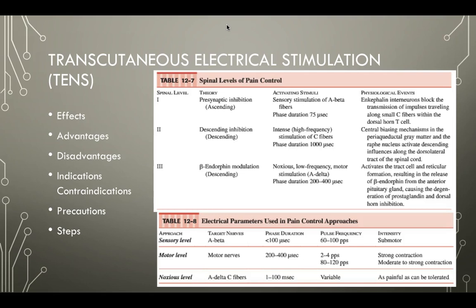The nice thing about the portable TENS units is obviously they allow individuals to have pain relief outside of treatment time. And so they're really the chance for someone post-surgery or in recovery to have some pain relief that is maybe not medication-based, which in today's society, with all the issues with opiate addiction and things like that, it's nice to have some alternatives that could potentially be available to them.